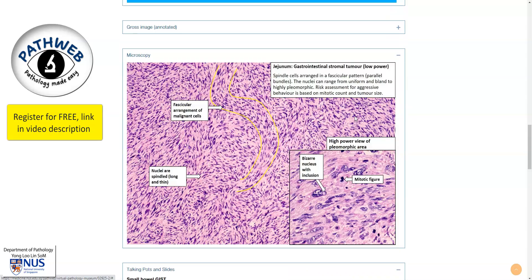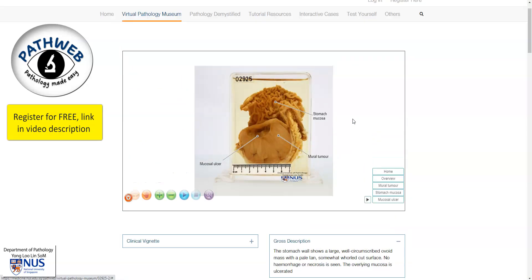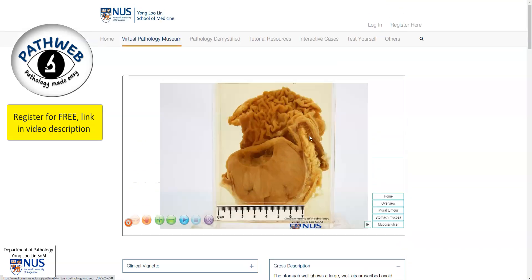So in summary, this is an example of a gastric GIST, which is a gastrointestinal stromal tumor — a very well-circumscribed, fleshy, tan mass that arises in the wall of the stomach beneath the mucosa, and in this instance causing gastric ulceration. Thank you.